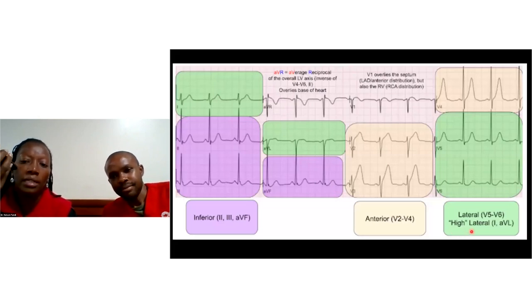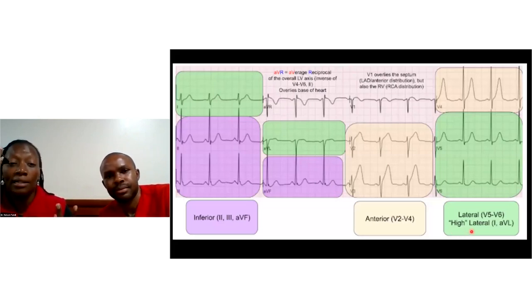So that is also very key, so that you have an instinct, an insight of which part of the myocardium, which part of the heart is affected. That may also help you to outline your management.